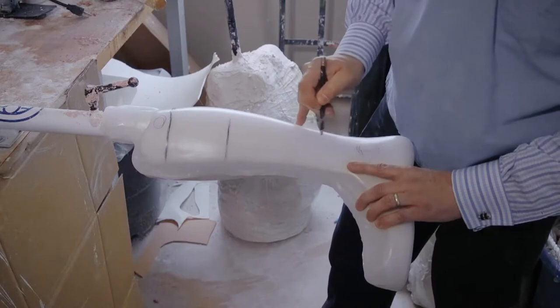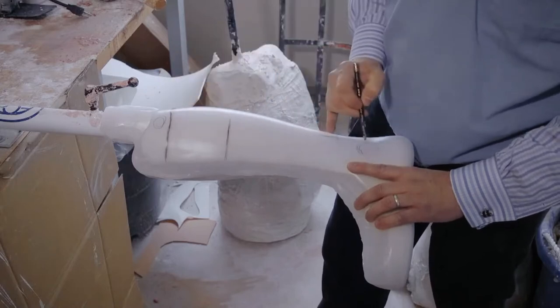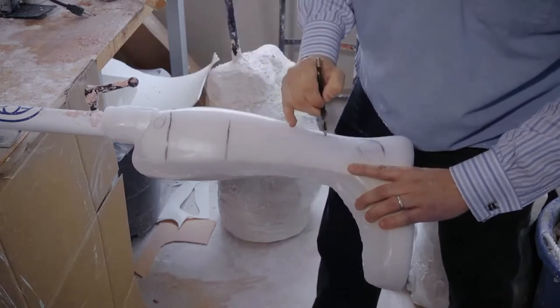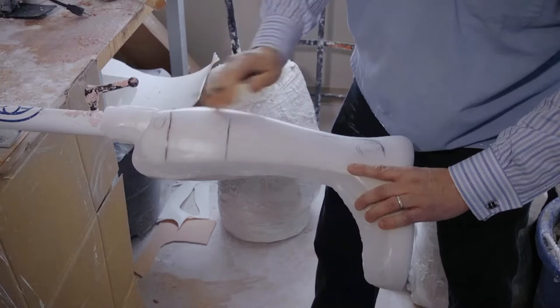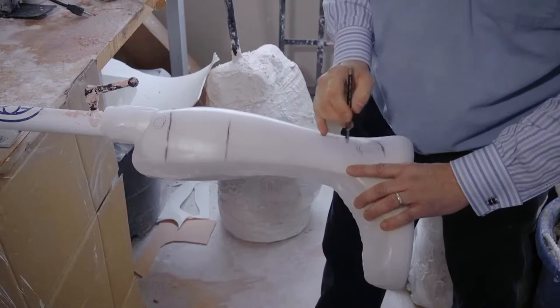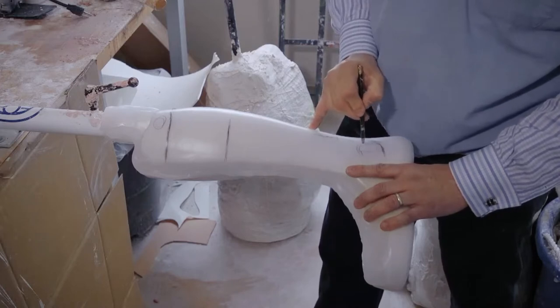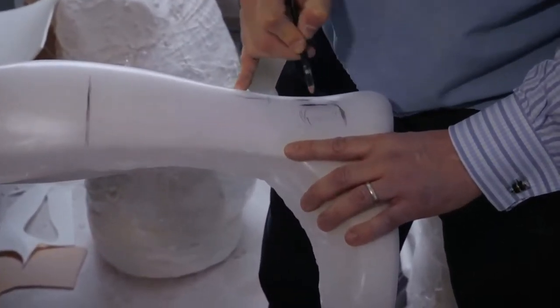Now, everyone's slightly different in their connection between this point and the top part of the AFO. But the basics of this is that it comes behind the ankle bone for a flexible AFO. And we would draw our lines up like this. I'm just going to cover some other ones before I start drawing too much and confuse anybody. A semi-rigid AFO, by many people's accounts, will come up more toward the ankle, but stay behind it. So we would be much closer here. That would be semi-rigid. Here's our flexible back here, our trim line back here.